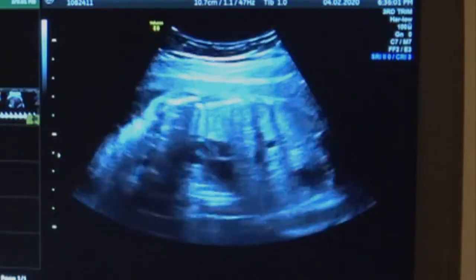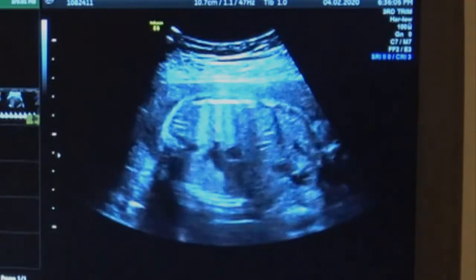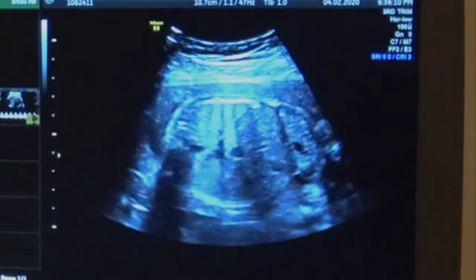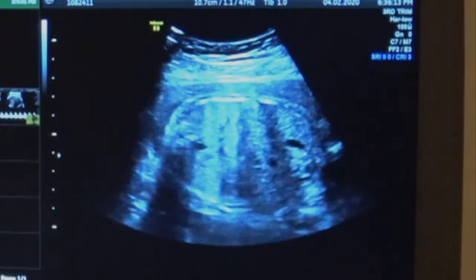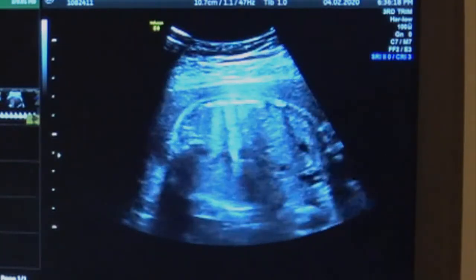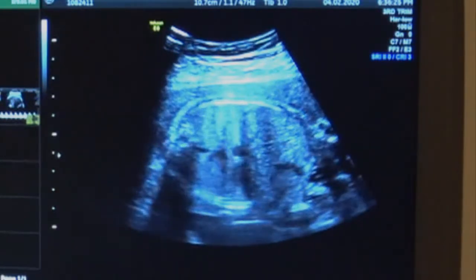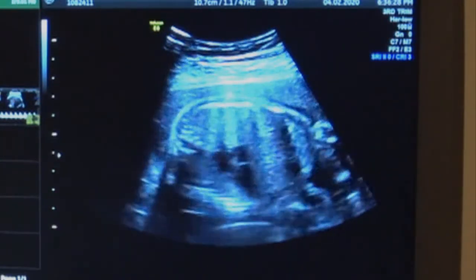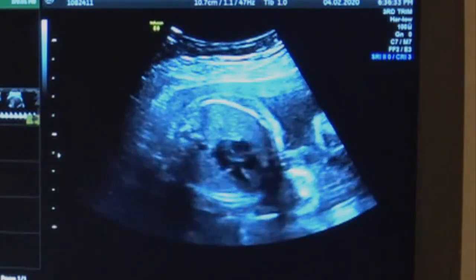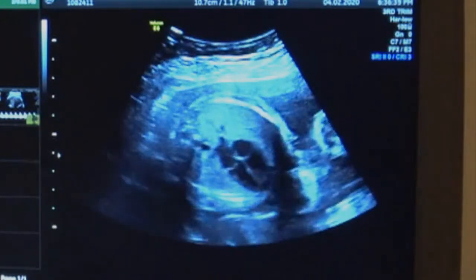Do you do them both standard in your third trimester, always MCA and umbilical? Yeah, beyond 24 weeks. Not really at 22. I guess if they're coming for a growth scan at 22, it's more about structure. I think there'd be other things that are the reason for that. Dopplers don't really mean much until 24. I just noticed a lot of the charts don't mean much until 24. Yeah, they don't necessarily kick in. Yeah, so that's our standard.